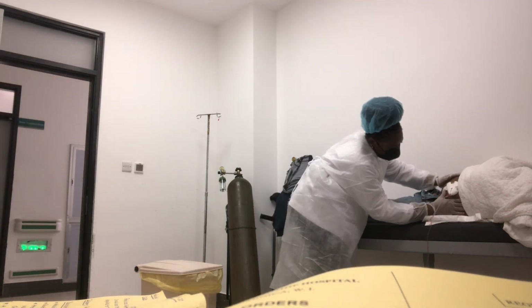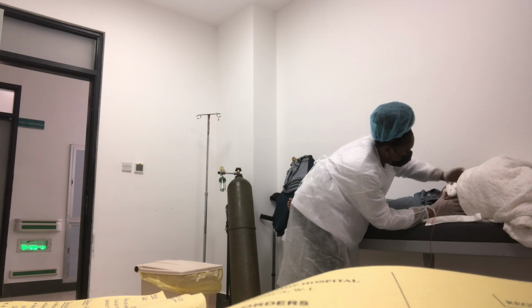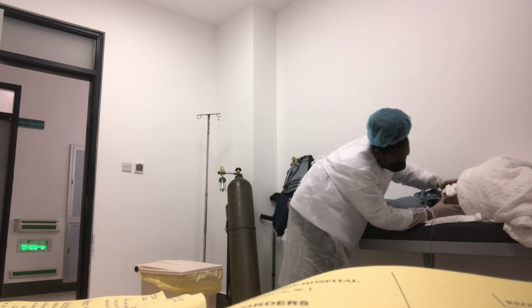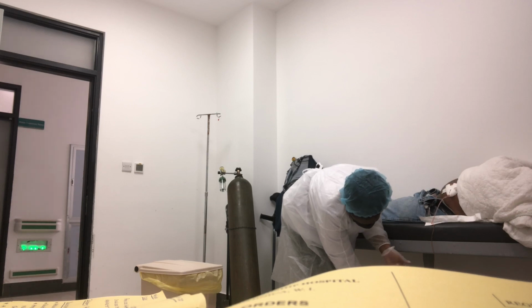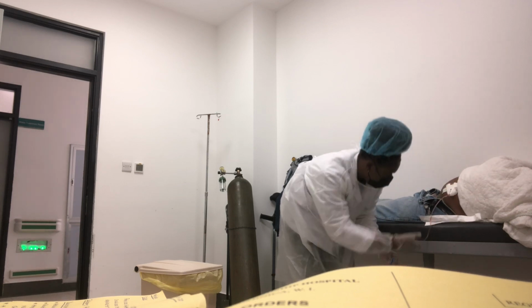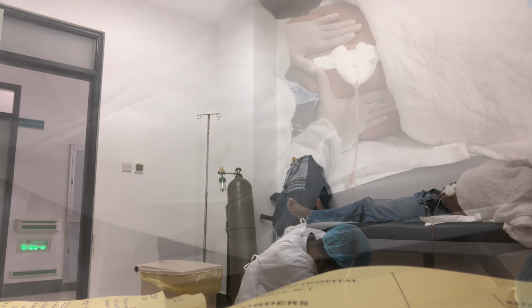So after a couple of minutes of the fluid draining out of the abdomen, I checked it, and I did a bit of palpation to see if a bit more fluid was going to come out, because we had already disposed of about 2 bottles. That's around 5,000 plus mils. So this was the 3rd bottle, and I was palpating to see if any more fluid was going to come out.